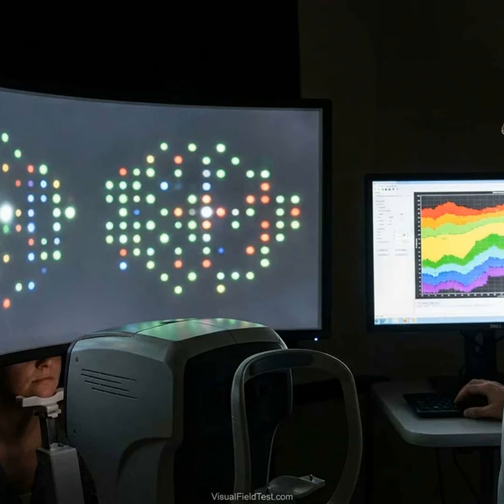If a targeted test shows a suspect defect, follow with OCT, OCTA imaging of that region, or more focused perimetry at the next appointment. For screening or busy clinics, it may be practical to alternate specialized tests. For example, do SWAP one year, FDT the next, rather than all tests every year. The goal is to gather pathway-specific data without doubling clinic visits or overwhelming the patient.